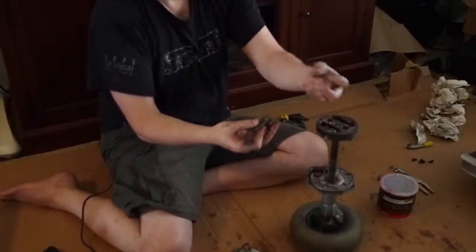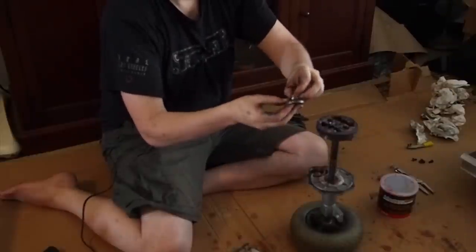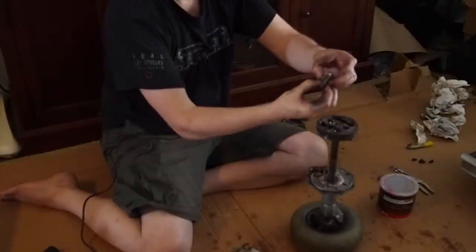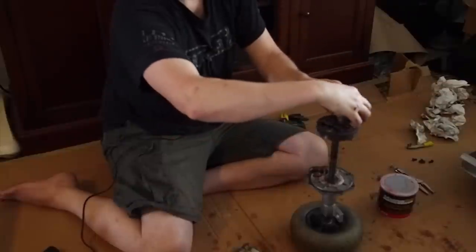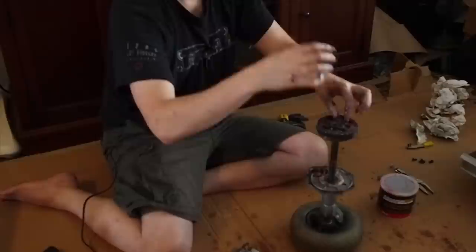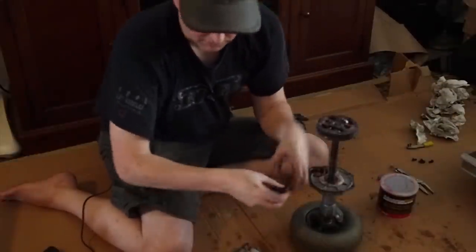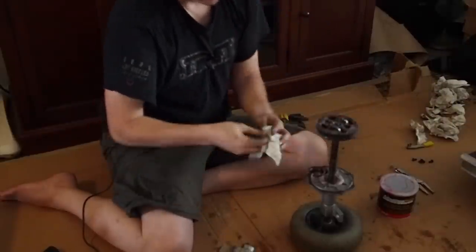They have two pieces. They have this little square piece that goes inside of a round washer, and that goes inside here, and that allows this gear to sit freely inside this gear. So wherever this gear is floating, it can float along with it. Same thing with this gear. The reason why I took this apart wasn't really to show you what I did.